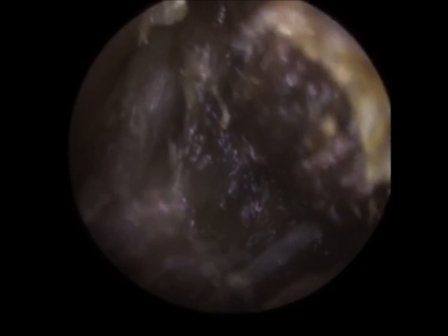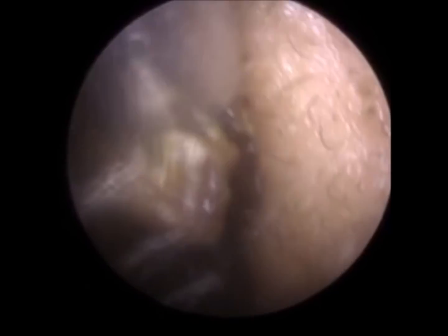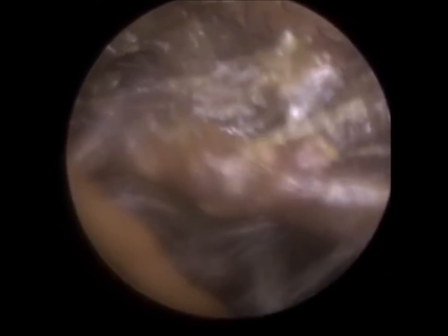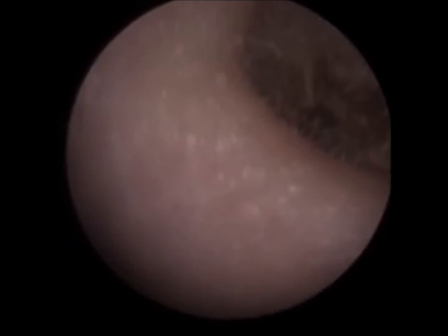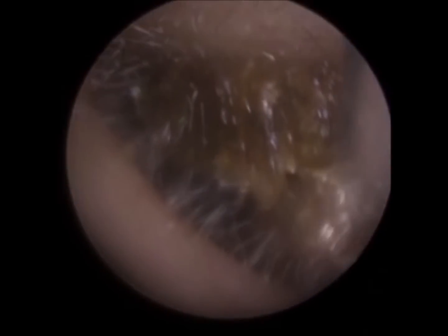The patient is currently working from home during lockdown, as many people are, and she's having to be on the phone constantly in Zoom meetings, so her hearing is very important to her, as it is for everyone really. So just using a suction probe, you see a bit of keratin there attached to the wax, just removing that, peeling that from the roof of the ear canal.